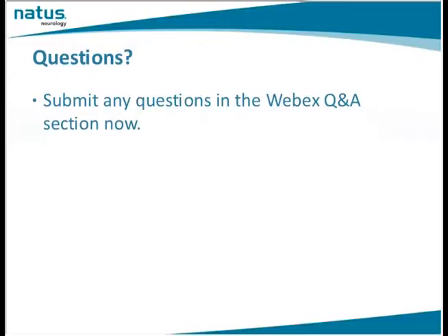This is the question: can I monitor the basilar artery continuously? That's a really good question. Have I monitored the basilar? Yes, but you can't use the headgear. What you have to do is find the basilar and literally hold it for half an hour or an hour, depending on how long the doctor wants you to hold it. It's painful ergonomically on your wrist. The best is to have the patient lay on their side, prop your hand up and just hold it manually, but you cannot use the headgear.